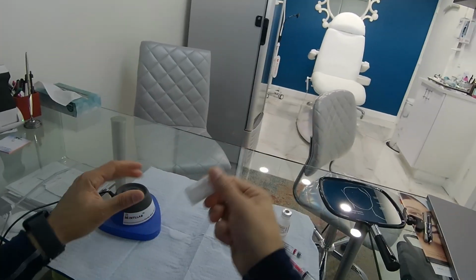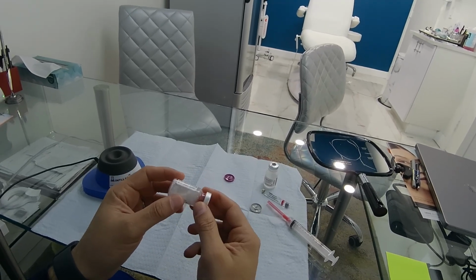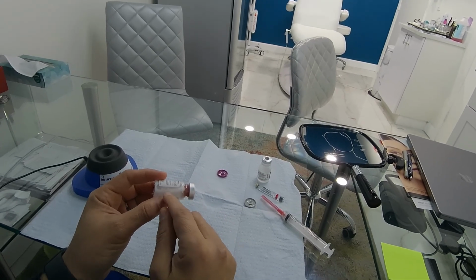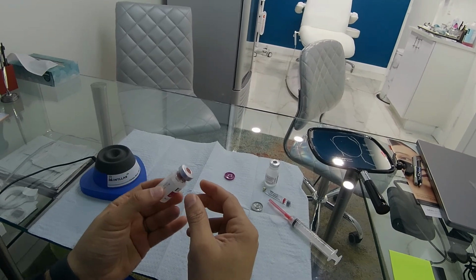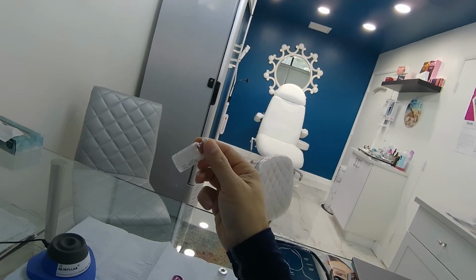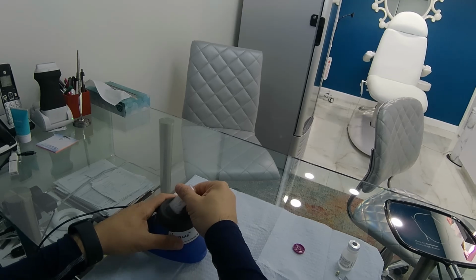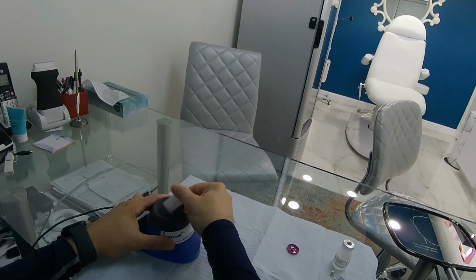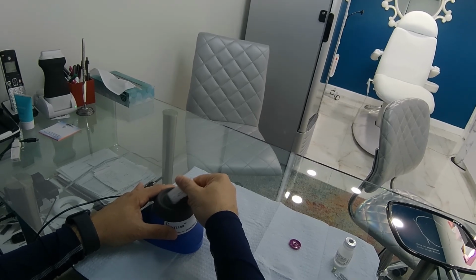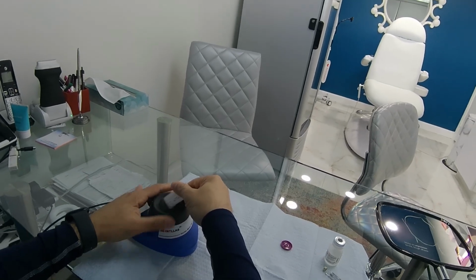Again, you keep mixing. The idea again is just to make sure that you have no clumps. That whitish thing is cellulose, that's not going to go away, so that's not really the clumps and the particles of the Sculptra, but wherever you think there's part of the Sculptra, you need to keep mixing till it all dissolves, and then it's actually safe to inject it. Mixing it beforehand is just to prevent the forming of nodules. But honestly, if you really mix it even the same day, half an hour before, and you really mix it well, then it's safe to use.